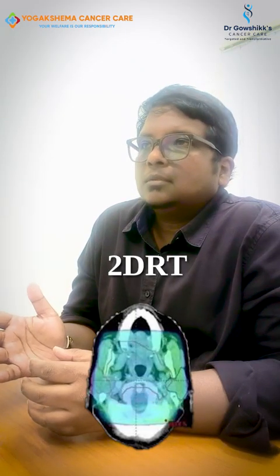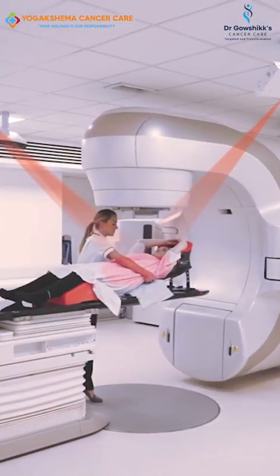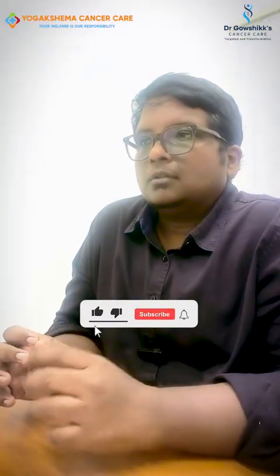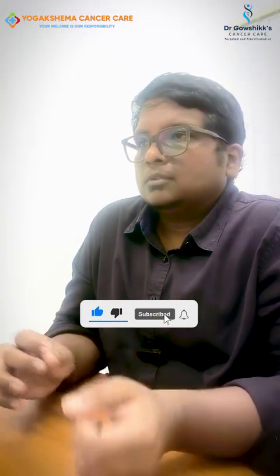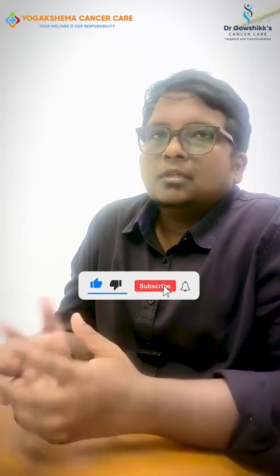2D RT is dubbed as conventional radiation therapy, wherein we use open radiation fields to treat the tumor and its surrounding site. It's more like if there is a stain on the wall and you want to clean it, and all you have is a bucket and some amount of water in that. How do you clean it? Take some water and just throw it at the wall. So the stain will definitely go, but the surrounding area will also get wet. That's what happens when the 2D RT technique is used.